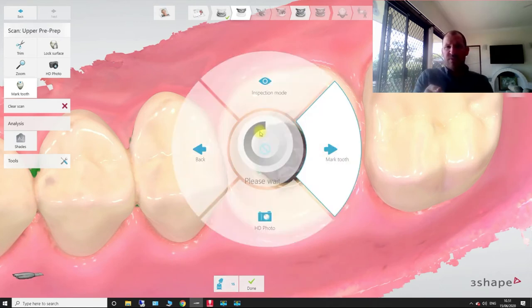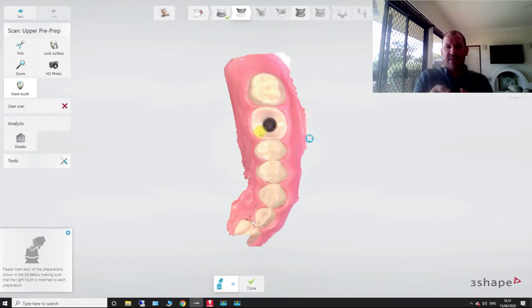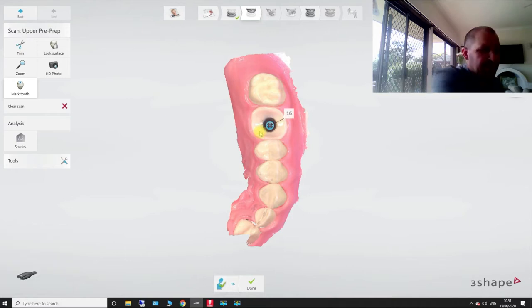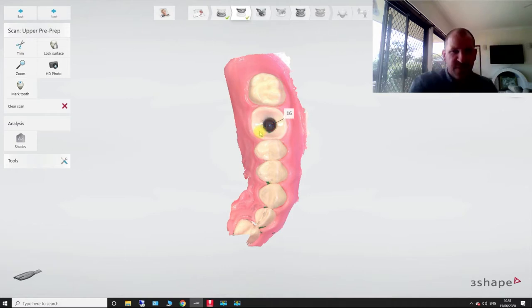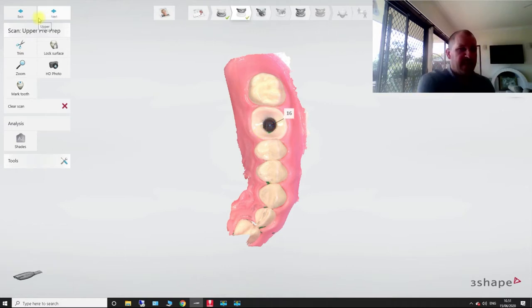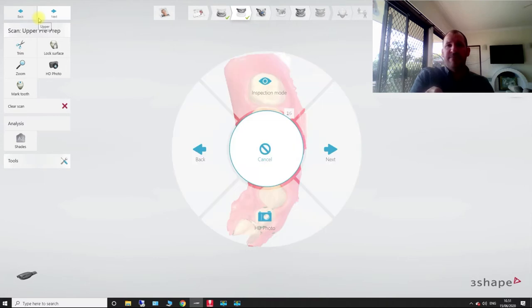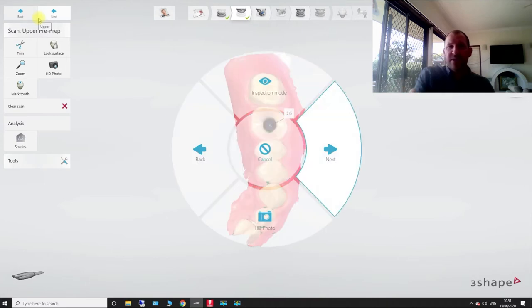And we're going to move to the right. And it's going to ask us to mark the tooth. So we mark the tooth in the middle. Hopefully we haven't had five coffees at this point in time. And then we can once again use a scanner and go next.